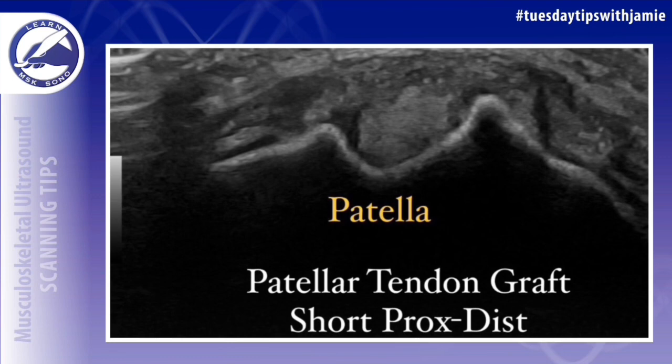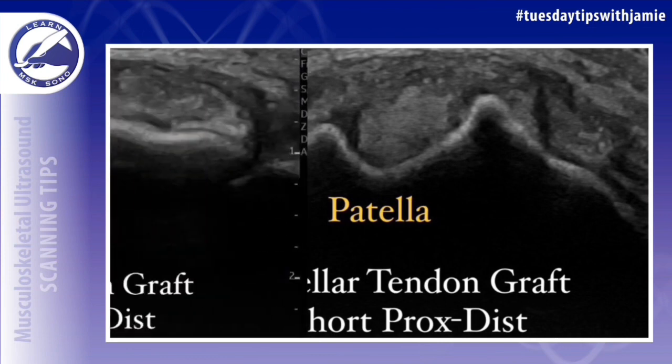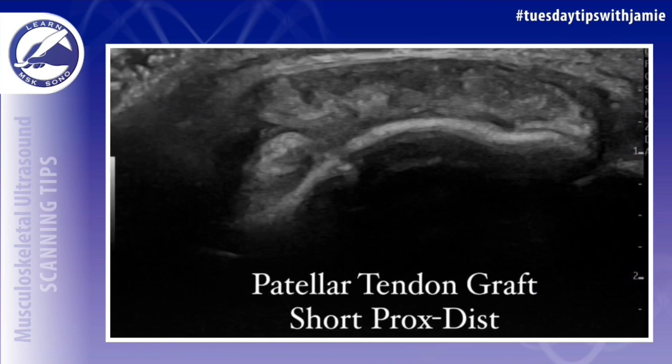In this example, the patient had a right patellar tendon graft reconstruction of the ACL 4 months prior to this ultrasound. I included images of a normal right patellar tendon to show the difference in the appearance.